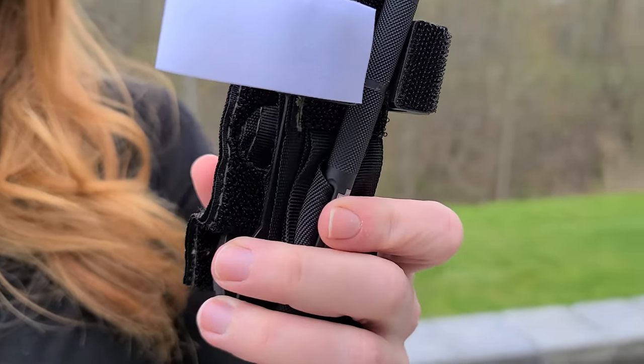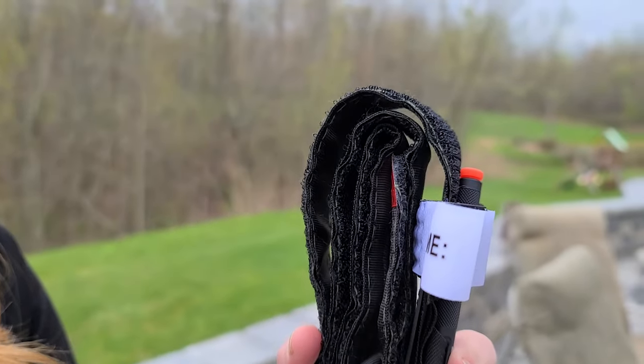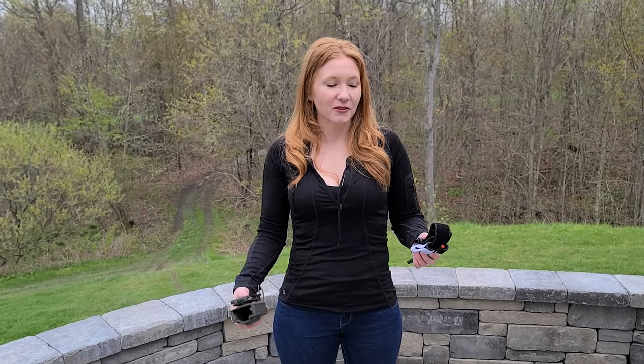So it ends up looking something like this. Here comes the positive and the negative. Having it like this is very useful and easy to use, but the one drawback is that it's hard to find pouches or holsters that are going to fit it, because it's a lot fatter this way.